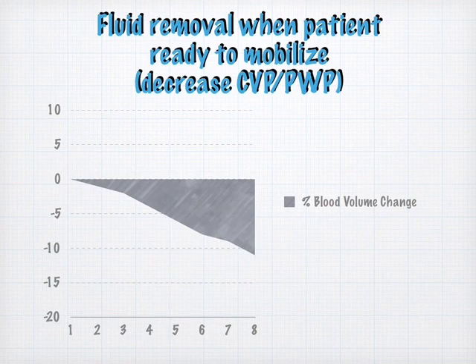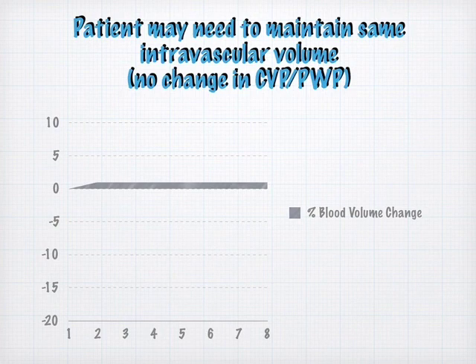So on this graph, this is what you would want to see on a patient that you want to remove fluid from their intravascular space, because this patient is hypervolemic. So you want to decrease their CVP, you want to decrease their wedge pressure, so we want to see a percent blood volume change. We want to see fluid being removed from their intravascular space. So this graph here is showing that some patients we might want to maintain the same intravascular volume on.